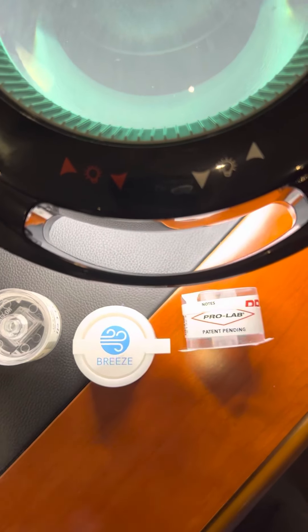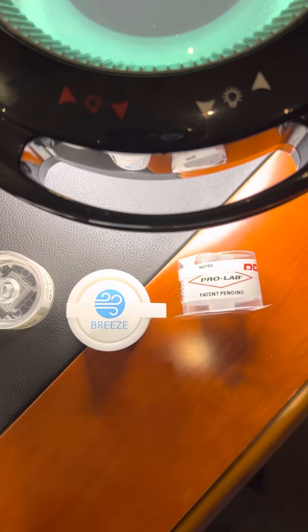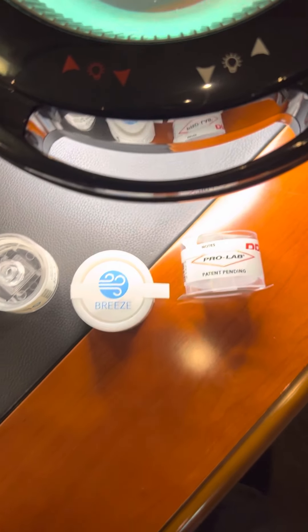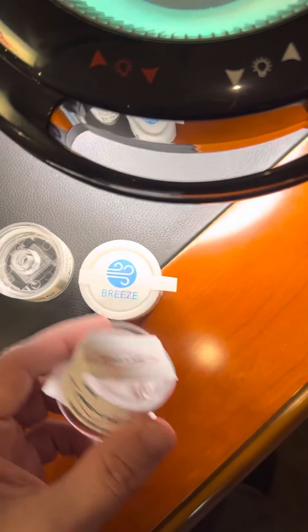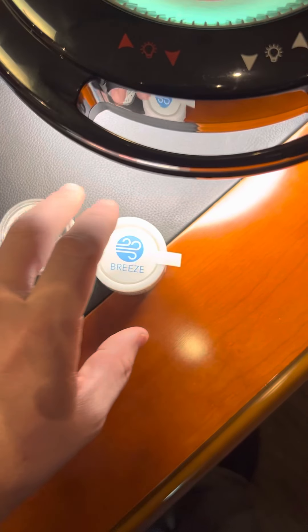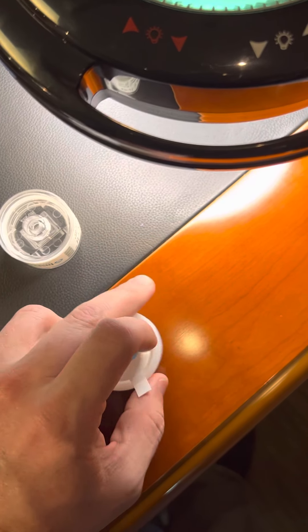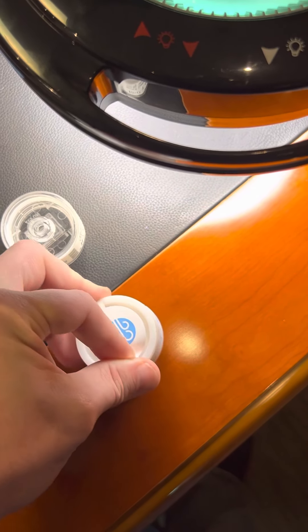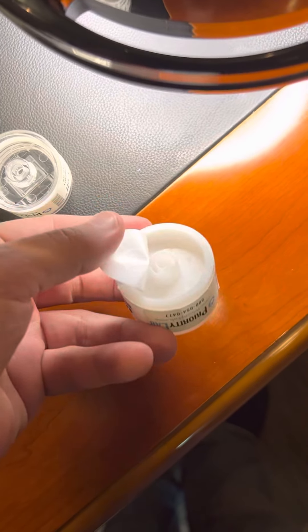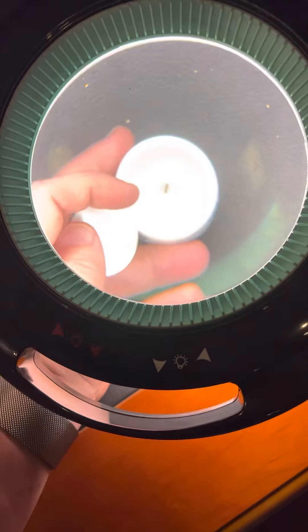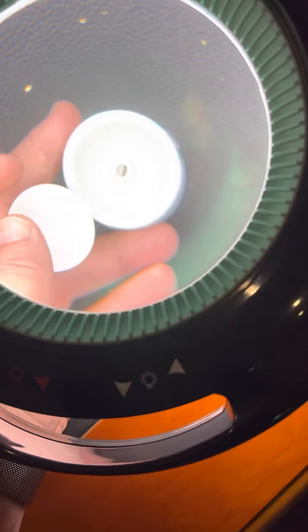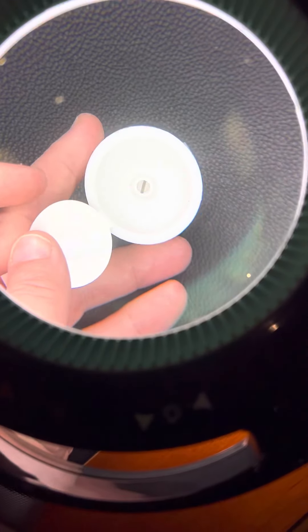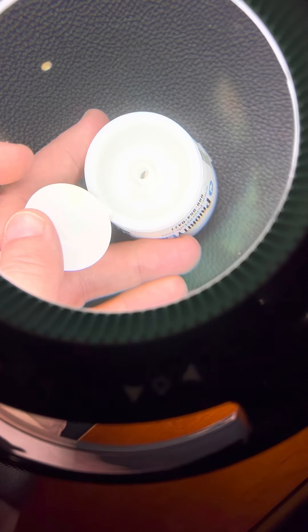Now, last on the list here is a quality product from ProLab. This is also a cassette. Now, on this, you won't see any branding of Zefon. And the reason for that, and here I'll show you under underneath the lamp here.